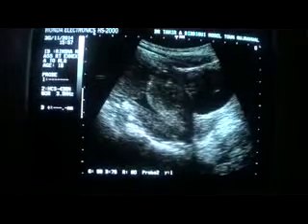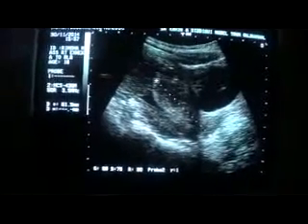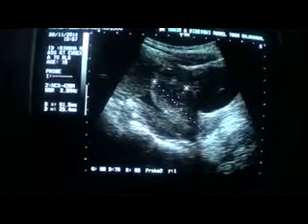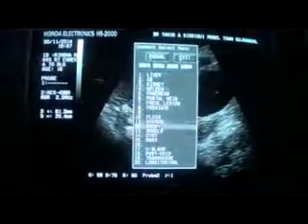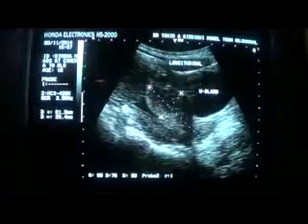This is the uterus in longitudinal section, measuring 6.1 by 2.5 centimeters, and is okay, keeping in view the nulliparous size. This is the urinary bladder. This is the longitudinal section, that of the uterus.